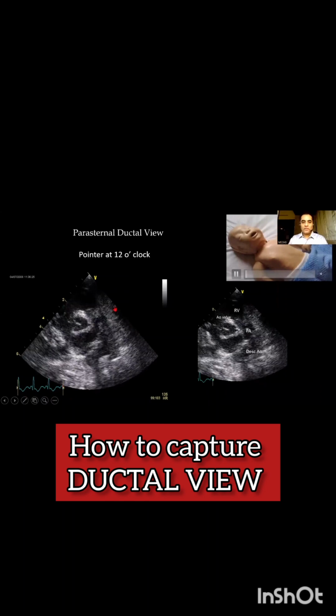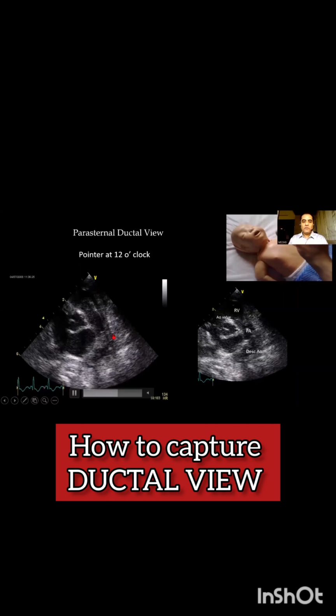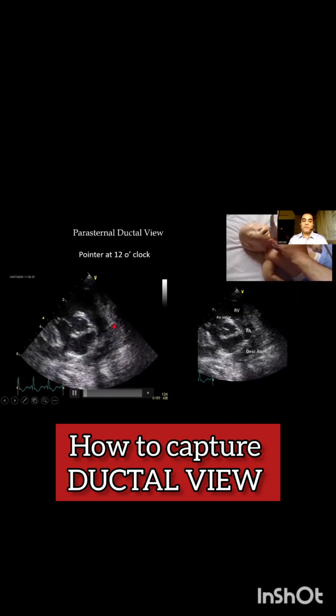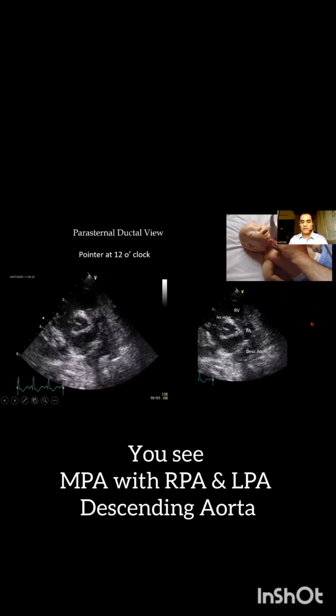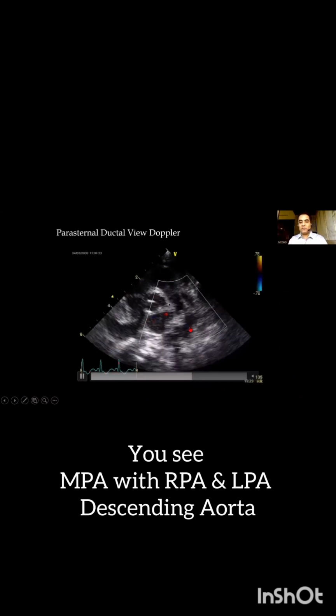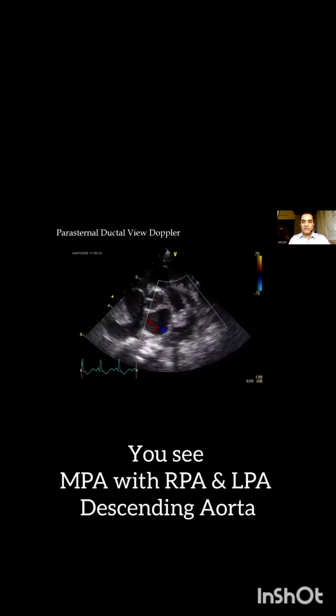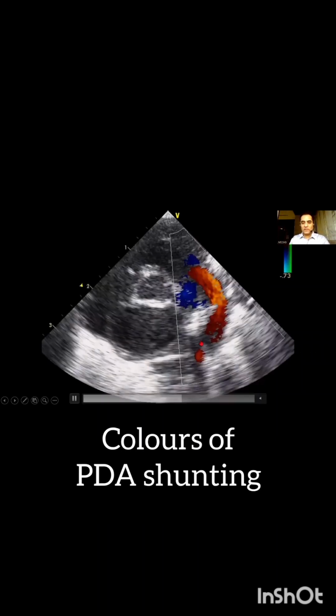As you can see on the mannequin, the probe has been kept in the high parasternal view on the left side of the sternum, and the probe orientation marker on the screen is on the upside, and you will be seeing this blue color, that is the main pulmonary artery, and then another vessel from down, that is the descending aorta. So if there is a PDA, it will be a connection from the descending aorta to this main pulmonary artery.